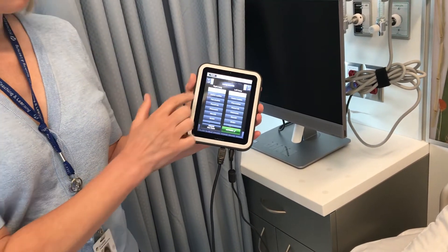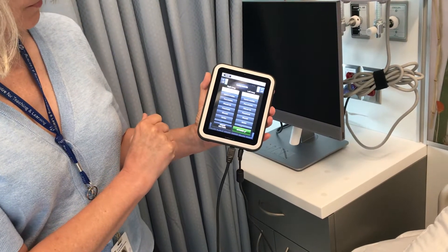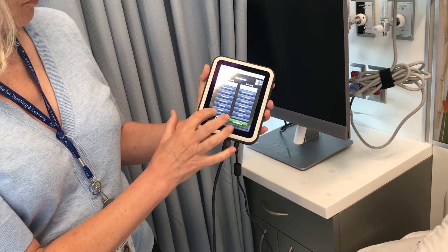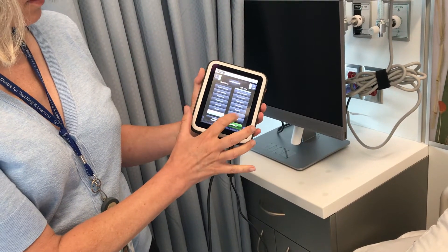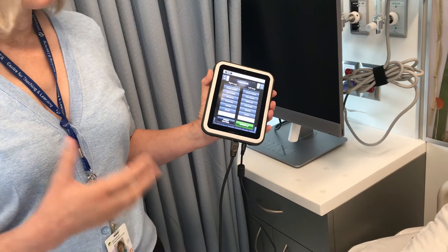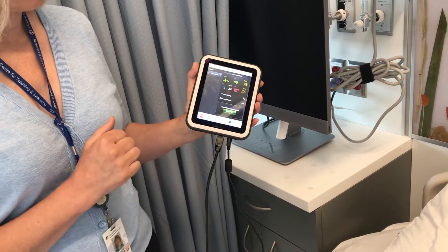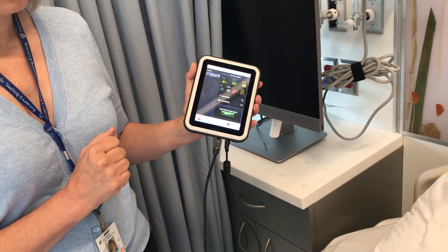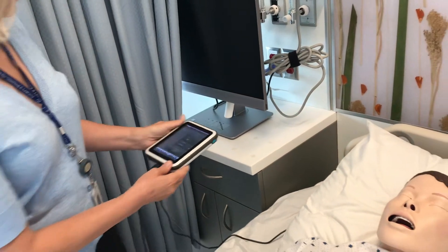Right now it's set for normal, but I'm going to choose different sounds. For instance, if I want wheeze, I'm going to slide down to the bottom where it says wheeze. For beginning class use and for testing, I'm going to have both sides the same. I hit the activate button, so with your stethoscope now you're going to be able to hear the wheeze.